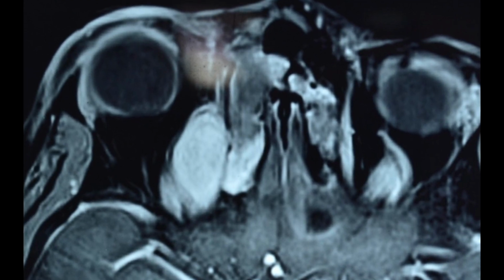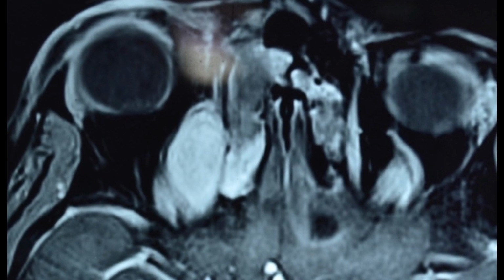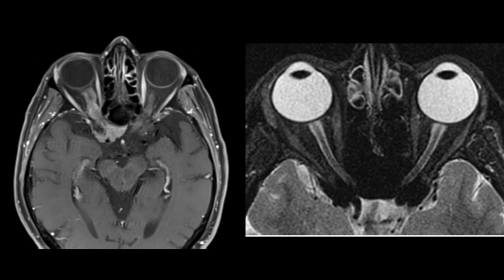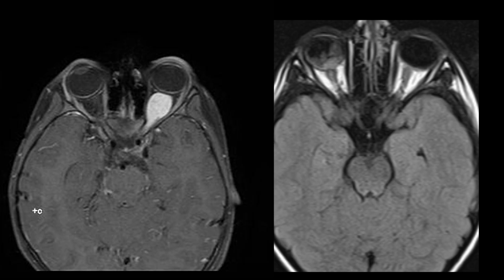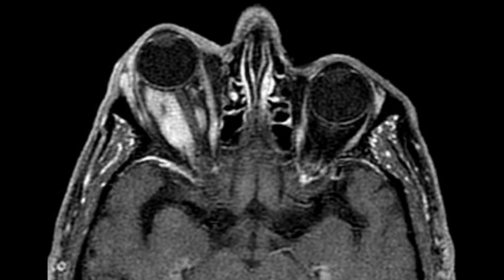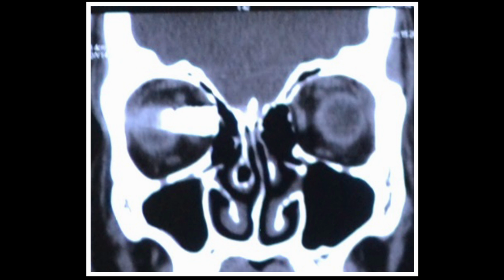MRI is usually indicated for lesions around the optic canal and orbital fissures. However, MRI has its own cons, like bony details not seen with clarity, calcific lesions being missed, and inability to be done in a metallic foreign body. A CT scan mostly remains our first line of choice. However, an MRI or an ultrasound can also be chosen based on the clinical scenario.